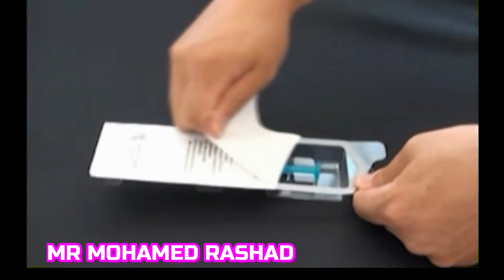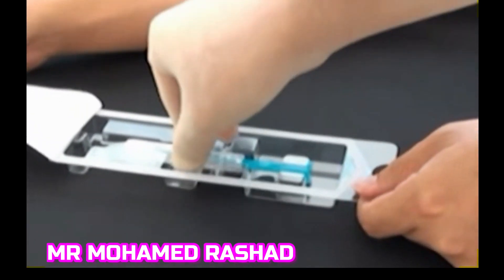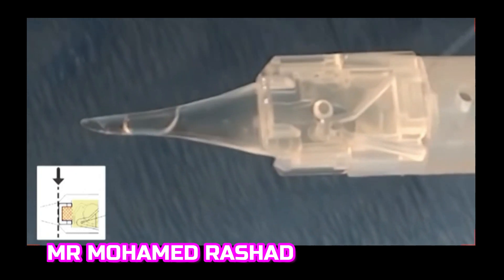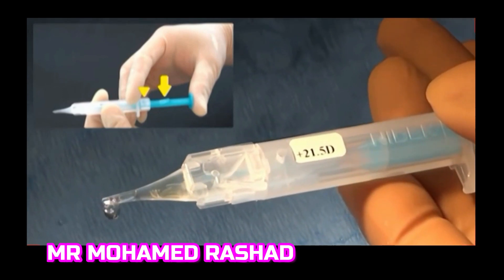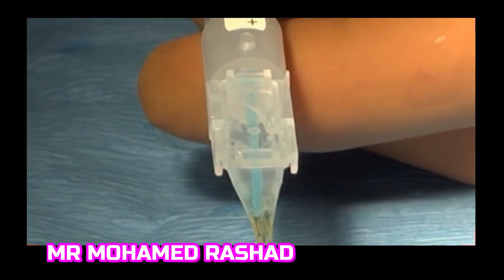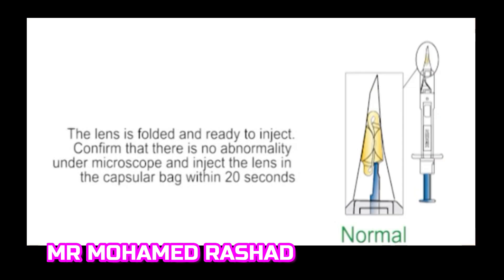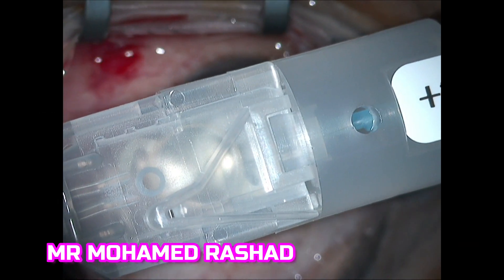After removing the cataract, we inject the cohesive viscoelastic and we open the back of the injector — the lens is preloaded already. There is a hole here where you have to inject low viscosity OVD. Then you push the plunger ideally with your thumb until the IOL is inside the nozzle as shown. You will feel a click when you push the plunger, then you stop. Check the orientation of the lens to be correct — it is ideal to use a low viscosity OVD.